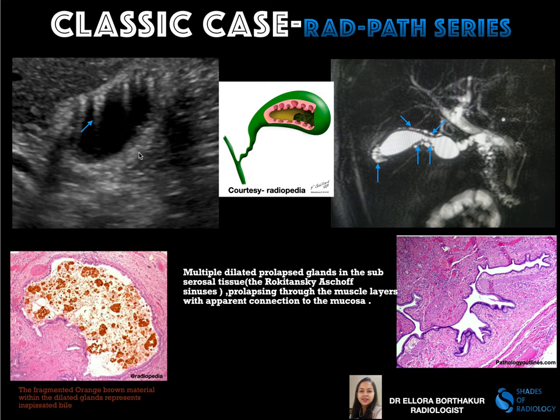You can see a gallbladder on ultrasound with multiple ring-down artifacts along the gallbladder wall. The same patient underwent MRCP, where you can see multiple cystic areas along the wall of the gallbladder. There was no significant abnormality in the bile ducts, common CBD, or even the duodenum.